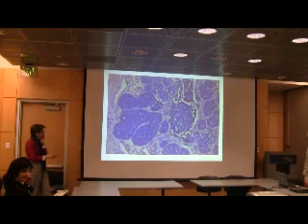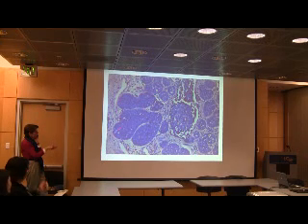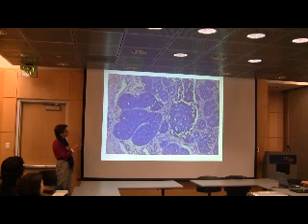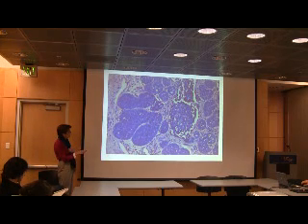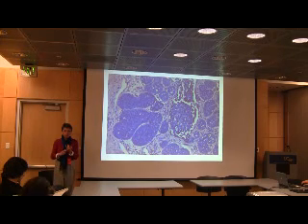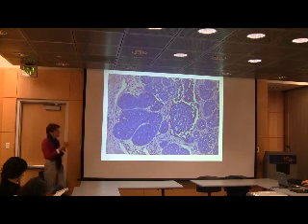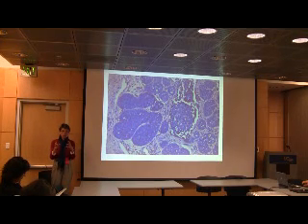All right, so here's an example of a lobule that has been greatly expanded by lobular carcinoma in situ. And the rule is, you can see what happened here is that the lobules no longer have any spaces in the center. The cells have proliferated, so they have crowded out those little spaces. And if you had something that just had crowded out the spaces, but the size of the lobule was still the right one, then we call it lobular hyperplasia. But it's not considered to be carcinoma in situ. But when you get the lobules expanded to this degree, then we call it lobular carcinoma in situ.